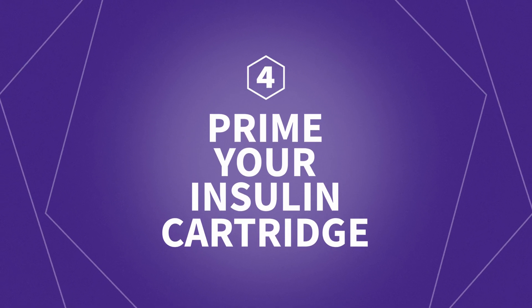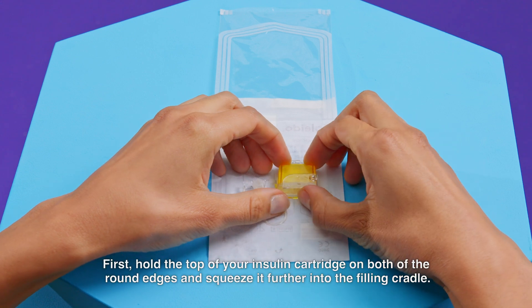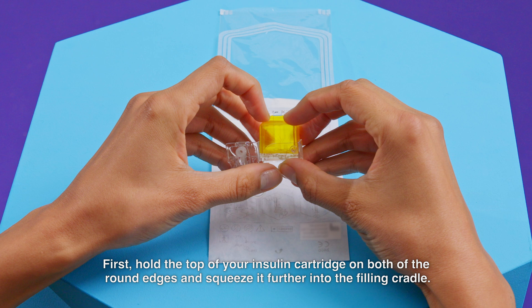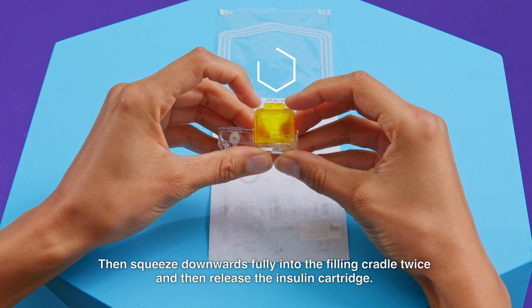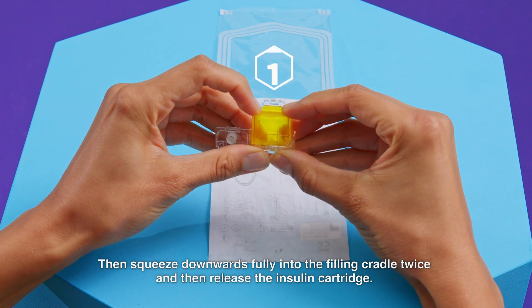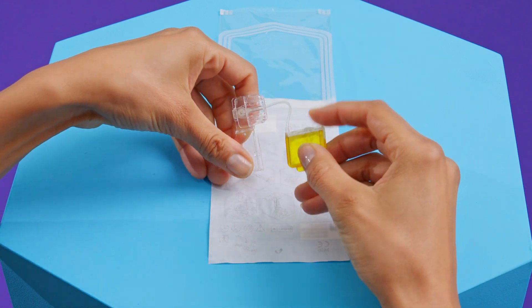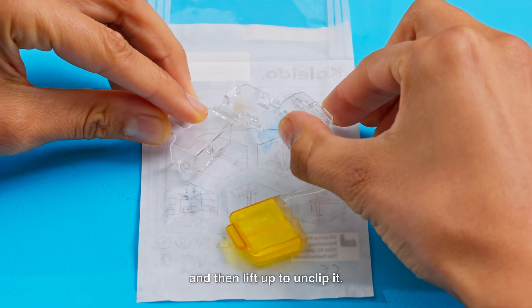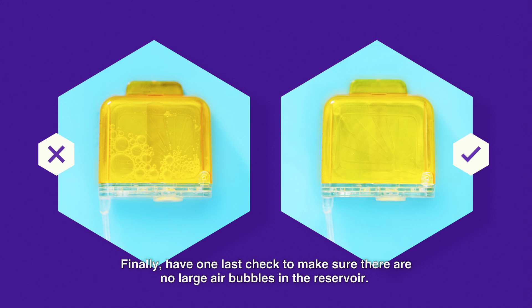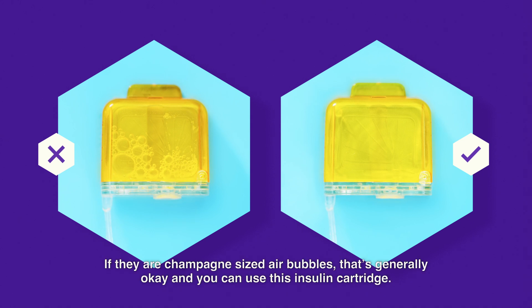Step 4: Prime your insulin cartridge. You will need to prime and then remove your insulin cartridge from the filling cradle. First, hold the top of your insulin cartridge on both of the round edges and squeeze it further into the filling cradle — this will unhook the plastic tab. Then, squeeze downwards fully into the filling cradle twice and then release the insulin cartridge. It is important that this action is done twice. You can now remove your insulin cartridge from the filling cradle. Turn your insulin cartridge over. Squeeze the tabs on either side of the insulin cartridge connector and then lift up to unclip it. Finally, have one last check to make sure there are no large air bubbles in the reservoir. If large air bubbles are present, discard and use another insulin cartridge. If they are champagne-sized air bubbles, that's generally okay and you can use this insulin cartridge.